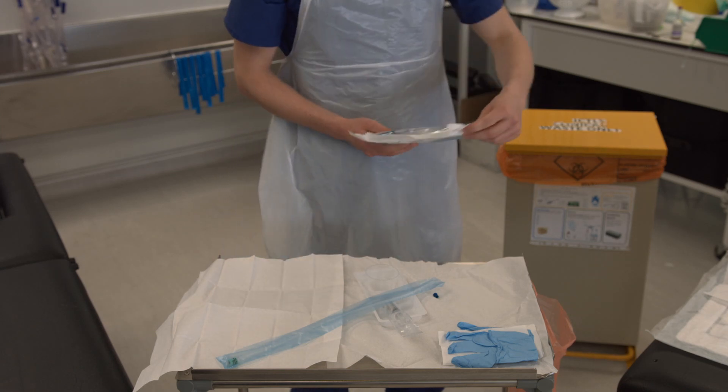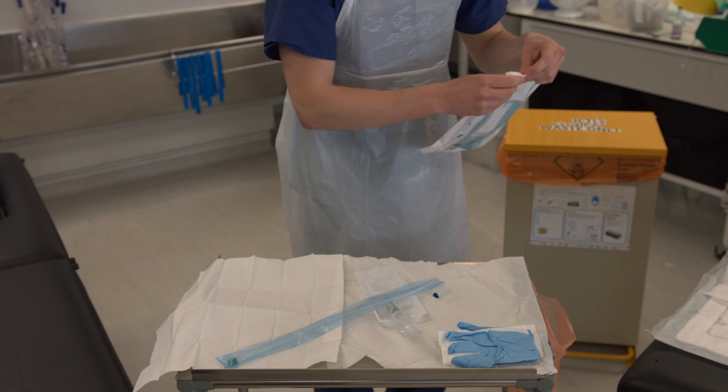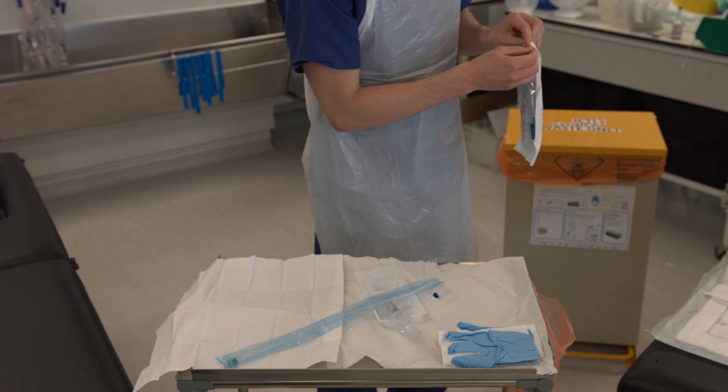Then open the package to your catheter bag and drop that onto the sterile field as well. Ensure no part of either of these falls outside your sterile field.